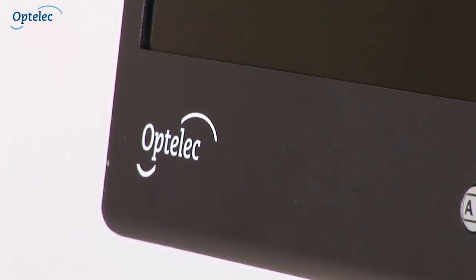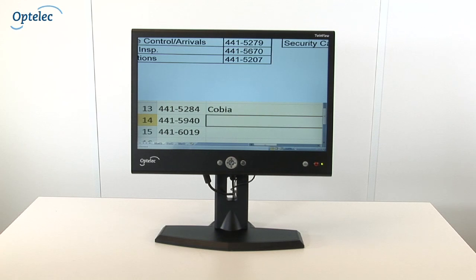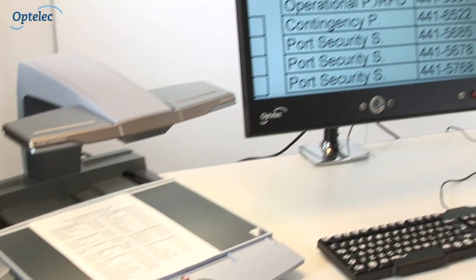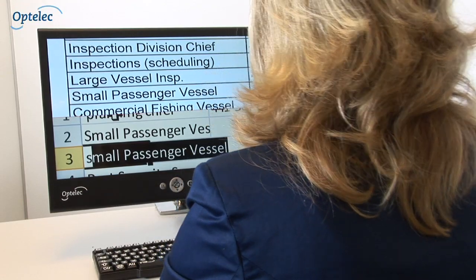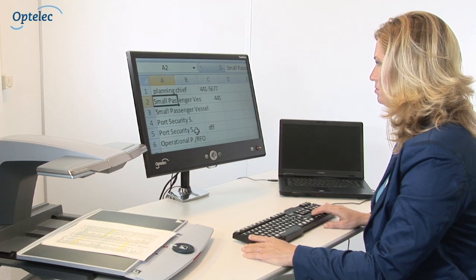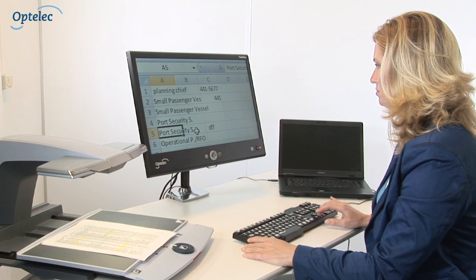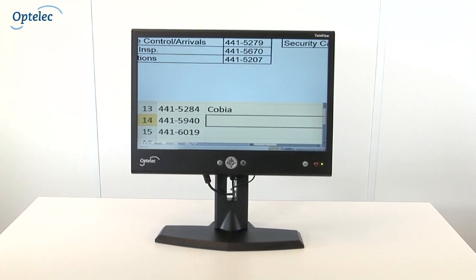The Optelec TwinView completes the ultimate low vision workstation, especially if you're looking for an ergonomic solution which will allow you to work with the ClearView Plus and a computer monitor simultaneously. The fact that the ClearView Plus and the computer are displayed on a single screen means you can work more effectively and maintain a clutter-free workstation, releasing valuable desk space as opposed to using two separate monitors.